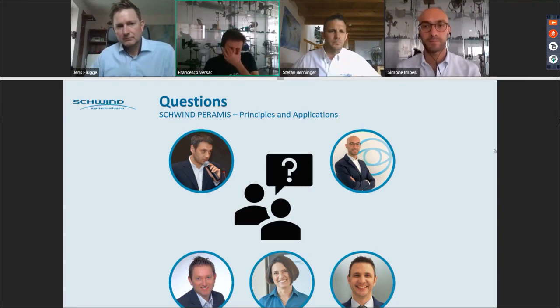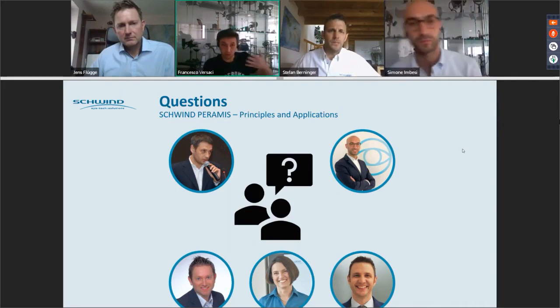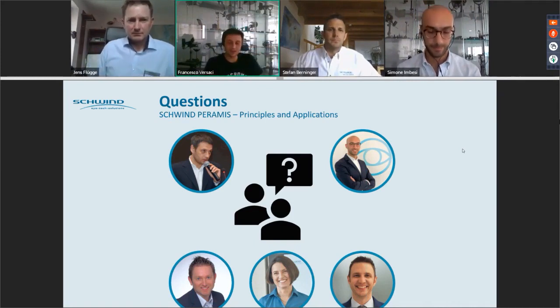What is important to say is that those cases are really simple to identify, and we provide a movie during the acquisition, so you can see if you have a kind of breakup, and you can see that the wavefront is changing during the acquisition. In this case, you absolutely have to repeat the acquisition, because you risk having bad information.